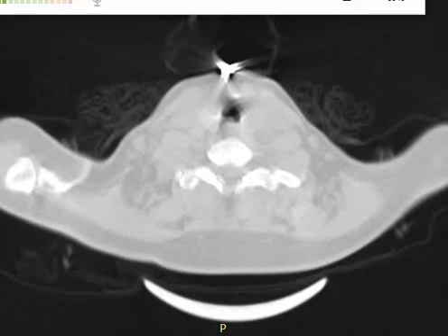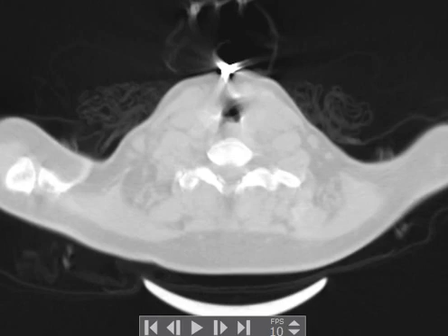Good evening, everyone. Today I wanted to share this case with you because of its grave importance in our daily practice right now. Everyone should be aware of that case and aware how to diagnose it correctly.